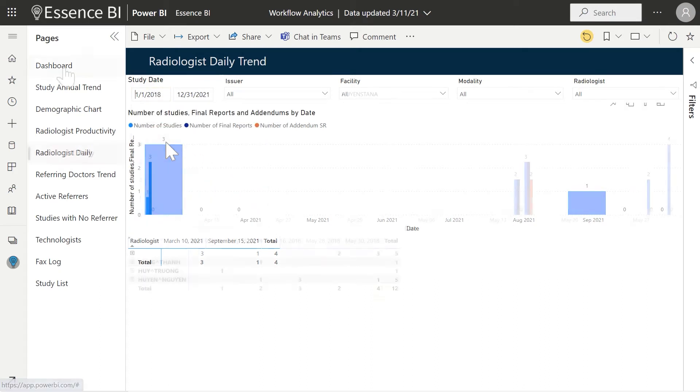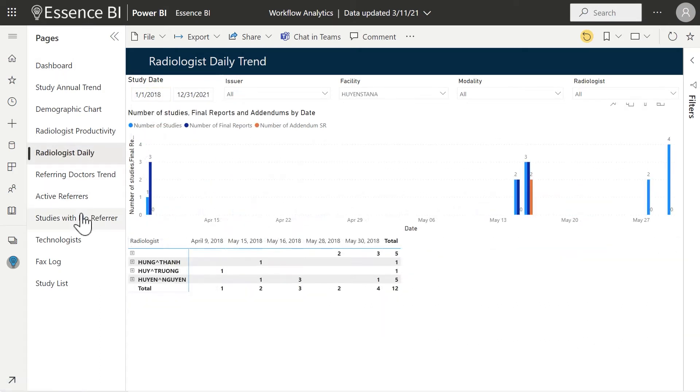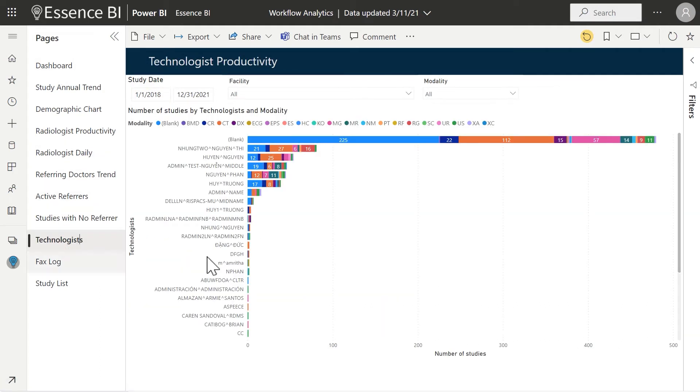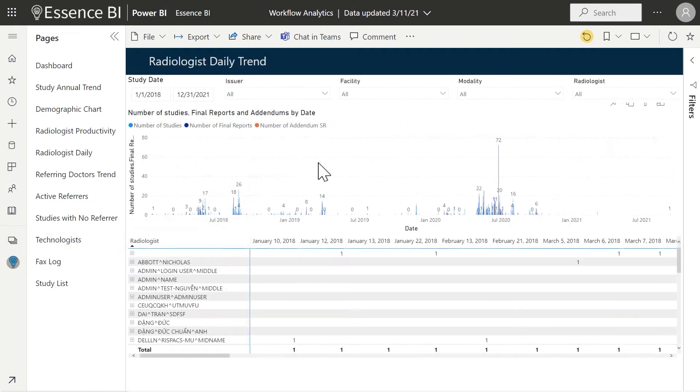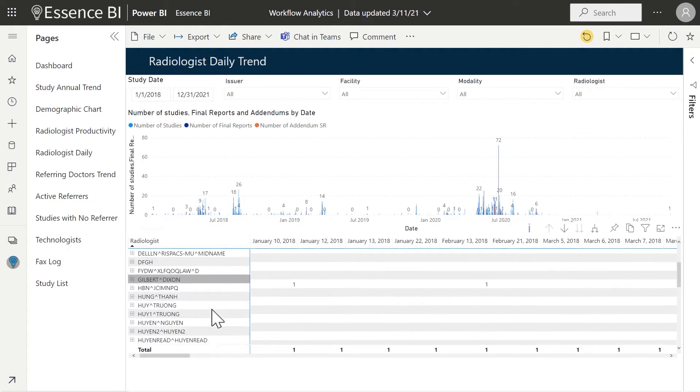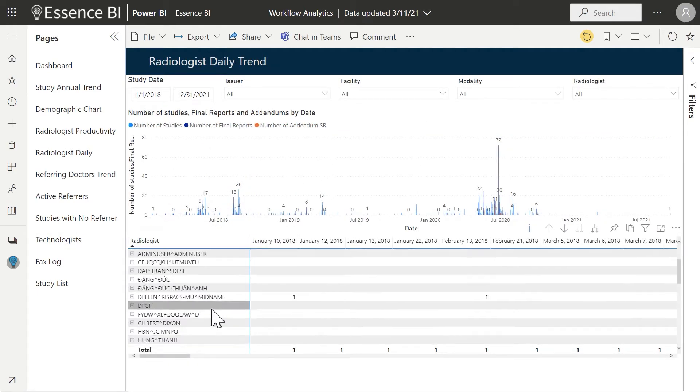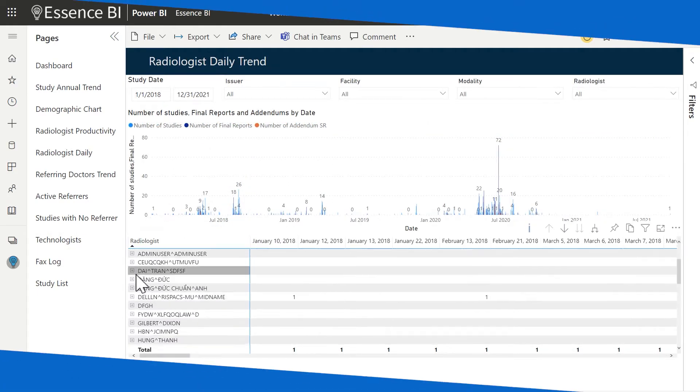what type of studies referred by what physician, for what facilities performed by what technologist, read by what radiologist, and what the turnaround time and RVU was for the studies on the list.